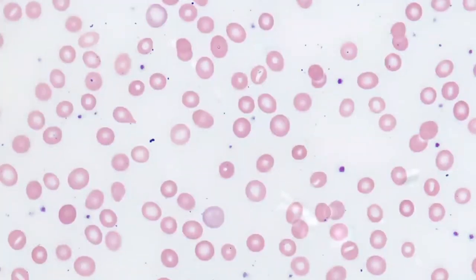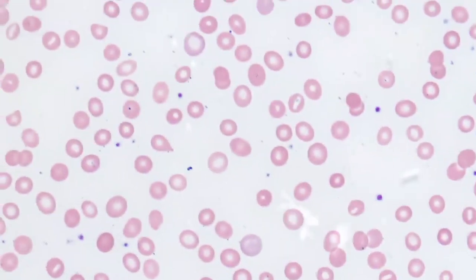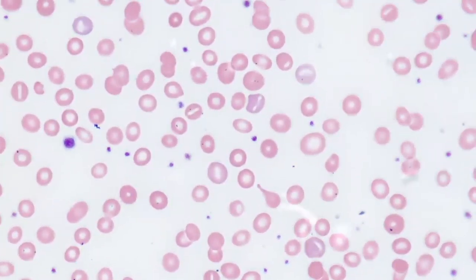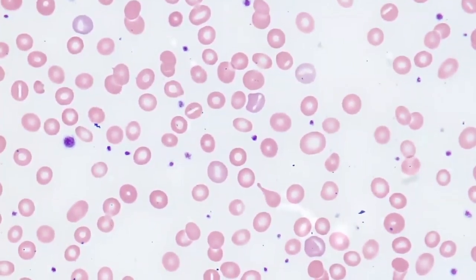Here we see, in contrast, a case of blood loss anemia. For this patient, they have increased white space between their red cells. However, their deficiency is not in iron, but actually they're losing blood. If we go a little bit closer, we'll notice some differences between the morphologies. Here we see that the red cells aren't necessarily decreased in size. There are far fewer elliptocytes than we were seeing in the previous case.